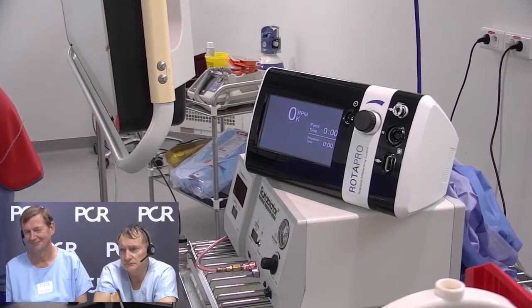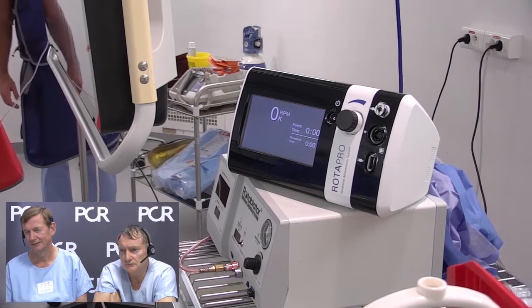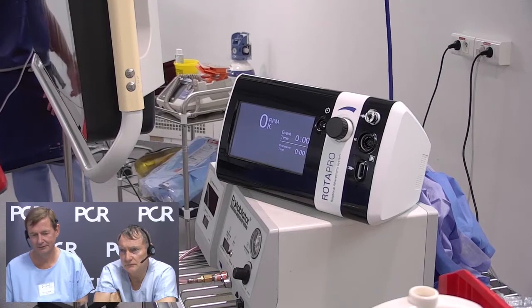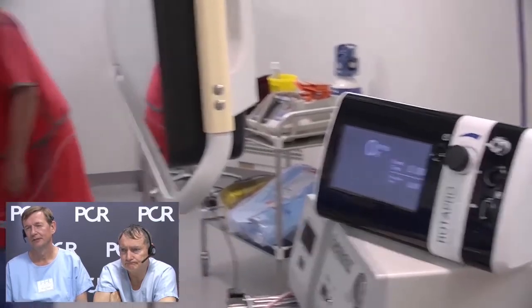It took some time, but as you know, we have a new version now. Black and white, and you will see while doing the procedure that there is lots of information that we can collect with the new system. So we are provided with interesting feedback, but let's prepare the system together as we go.